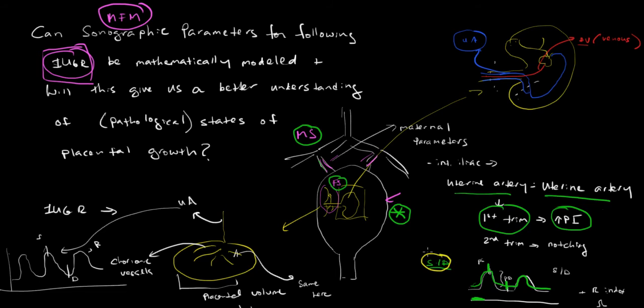And so the greater the systolic to diastolic ratio, and that gets calculated by the software into something called the pulsatility index, the index of the pulse, the difference between here and here, that gives you a sense of the resistance. And in addition, the resistance can be directly measured. And the resistance and the pulsatility index within the maternal circulation, even in the first trimester, is a marker of the fact that the fetus could develop ultimate IUGR.